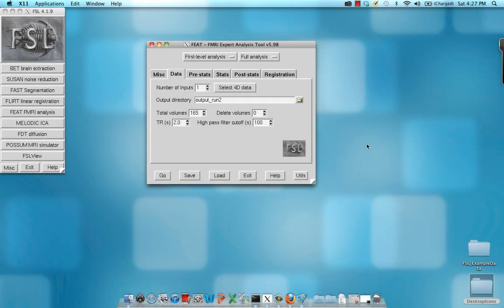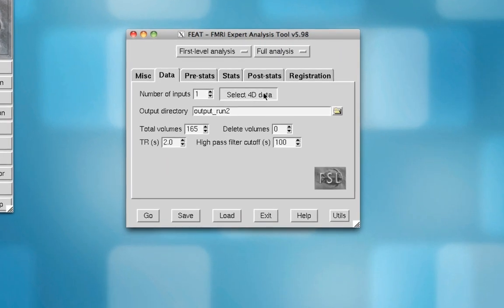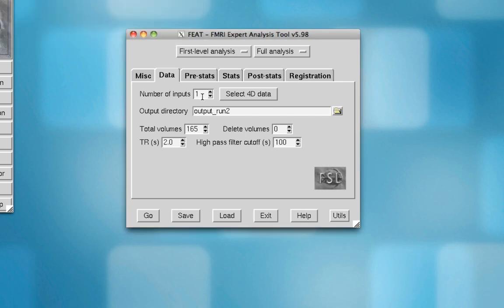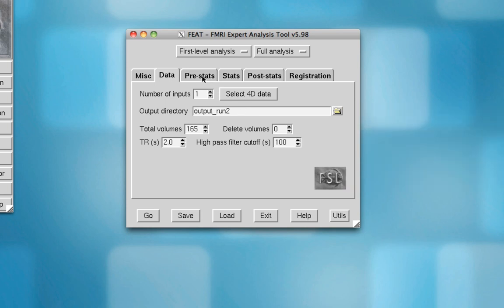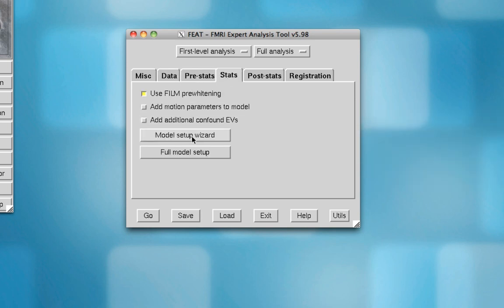Now that we're done running the analysis for the first run of our experiment and we've looked at the results, we now do the exact same thing to run 2. So this is the feed setup for run 2. All I've done is I've selected the next run, in this case S006A001, and I've changed the output directory to underscore run 2 just to differentiate them. But other than that, everything is exactly the same.